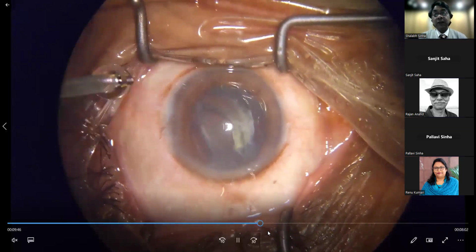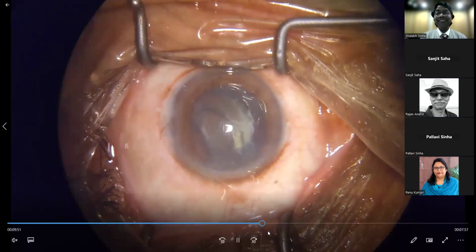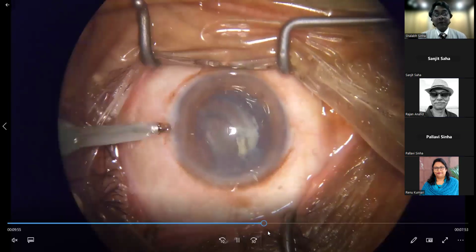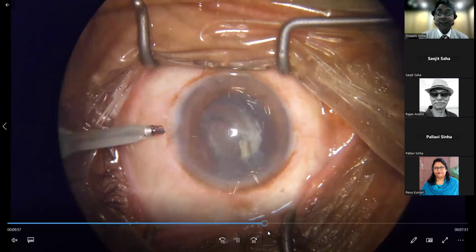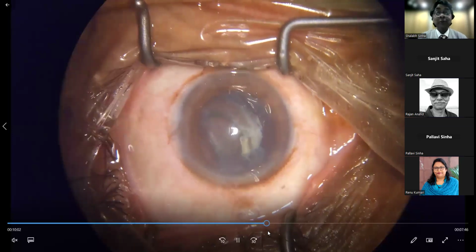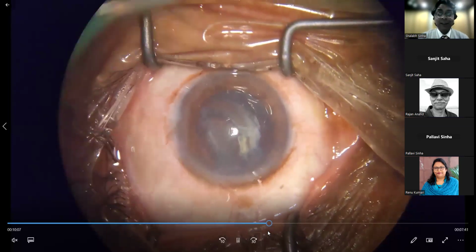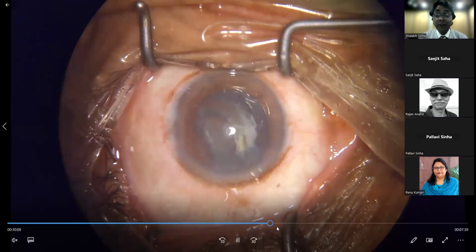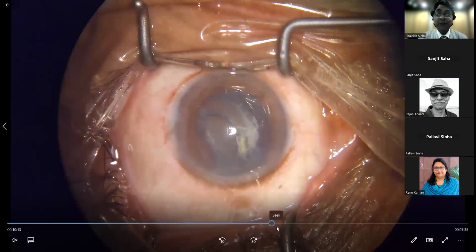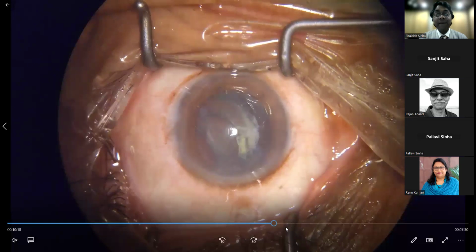So I was lucky that it was the collecting chamber that was full, not the bottle that was empty. That would have been the other danger. Yes, that is true. So as phaco surgeons, we need not only look at the eye, but also look at the fluid, and sometimes look at the collecting chamber. Especially the fluid, because if the fluid finishes, the other staff, if they see it in a difficult situation, when your mind is here, he or she can take care of that.